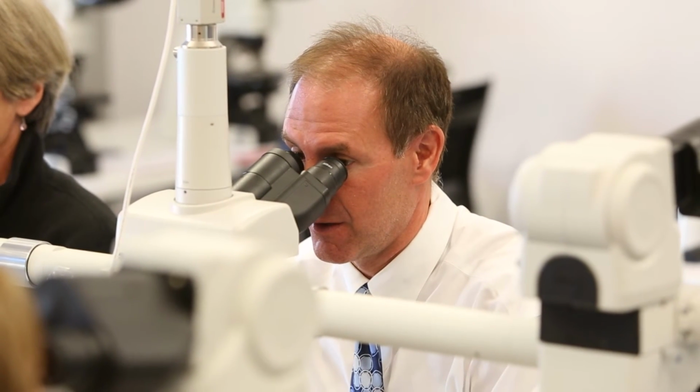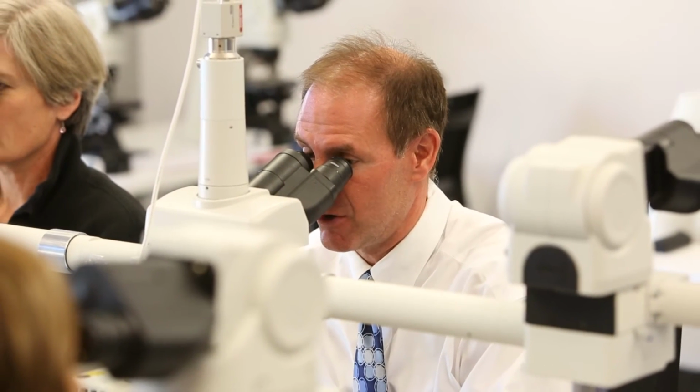What the participants will have when they sit down to preview the case is a simple case history that goes along with the glass slide that does not include the actual diagnosis, because you will discuss the diagnosis when you gather around the multi-headed microscope to discuss the cases with the participants.